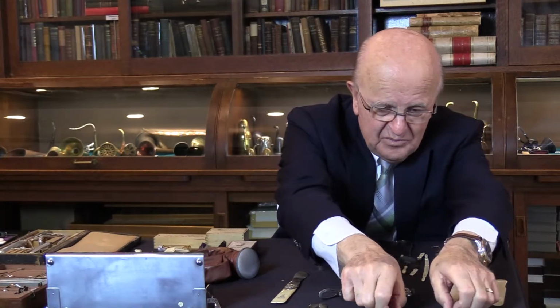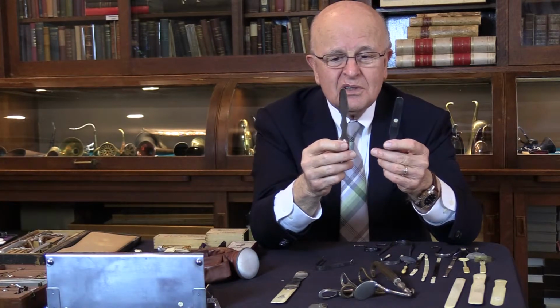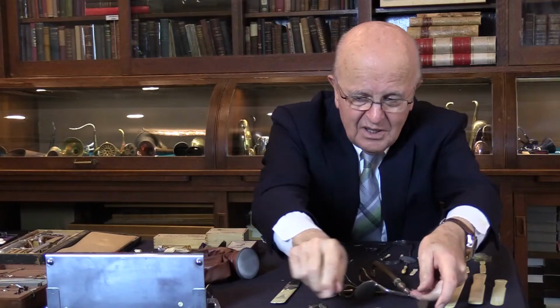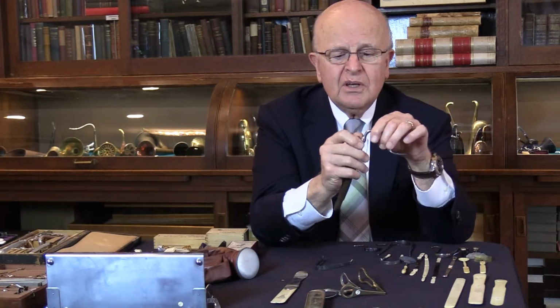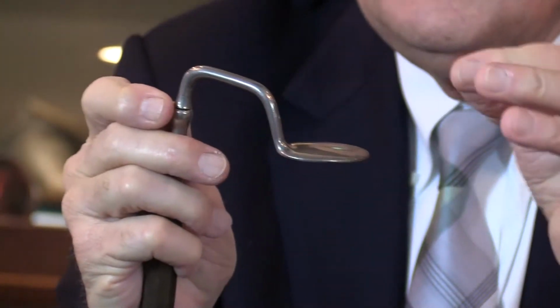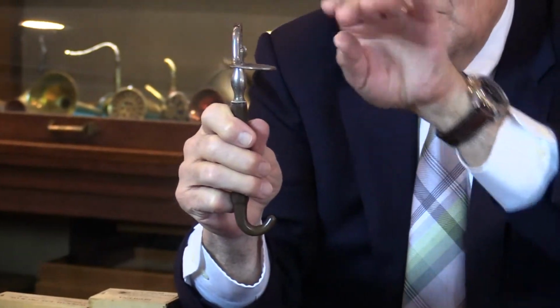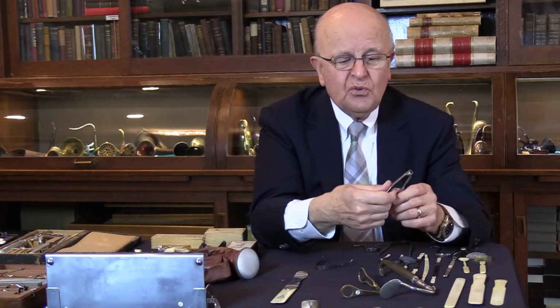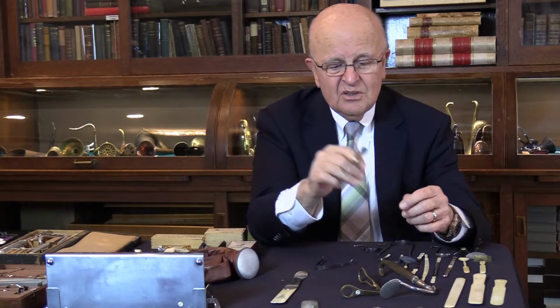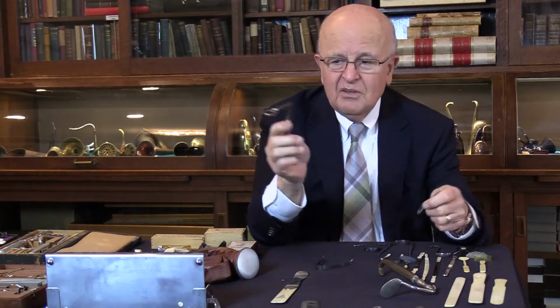Tongue blades, I have different examples, but I just want to share some of them with you. This is silver, this is metal here. Some of them are heavy. And then came this type of tongue blade, and you can change this here, put bigger or deeper. So it came in sets. So you just put it there, push the tongue down, and get it out of the way here by putting it at an angle. The next thing that came out was the folding tongue blades. So this is an example here, this is another example. And they are made of steel, brass.